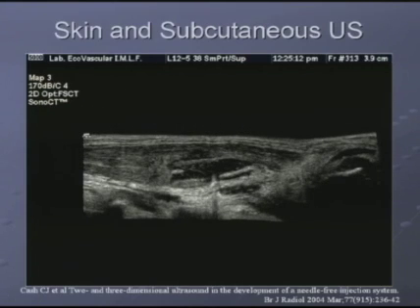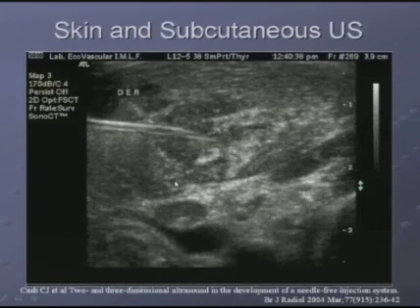Another example of the sternocleidomastoideus muscle, but this is a localized abscess. And here we are placing a needle. This is the tip of the needle, and here our intention was to take a sample for bacteriological purposes.